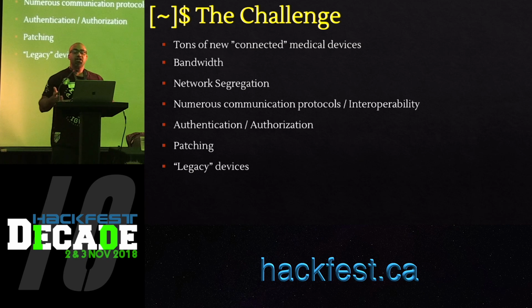And you can think of medical devices more like SCADA systems where functionality is priority over security. So they have to be online most of the time. So patching these devices isn't going to be an easy task to do.